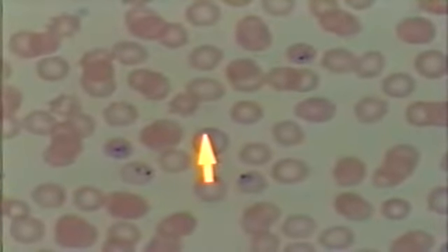When you look at the Plasmodium falciparum blood smear, what you'll notice is that there are no schizont stages, and if you remember, those particular stages develop in blood vessels that are closer to the center of the body, the very large vessels, and so you don't see schizonts in peripheral blood. And so that's the only criterion that I'm going to ask that you use for making those distinctions.